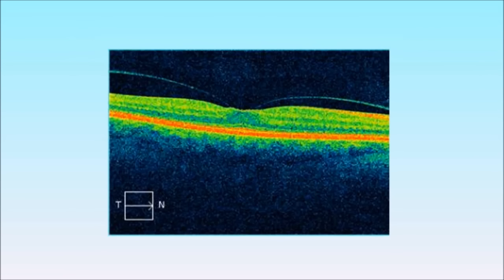In this image the jelly or vitreous in front of the retina is pulling away from it apart from at the central macular region. This is called vitromacular adhesion.